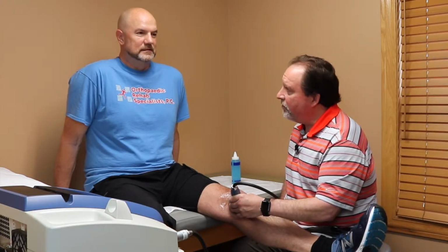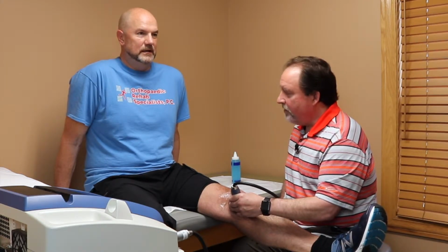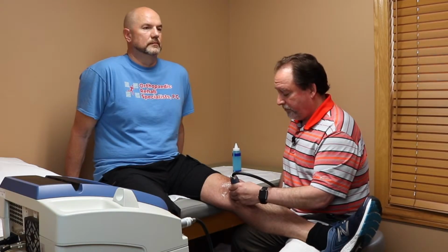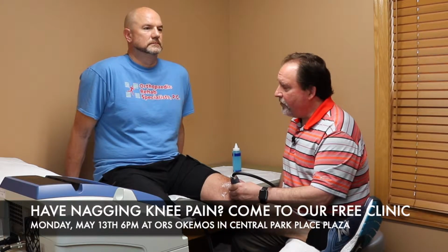Okay, we're down to 2 intensity. See, it doesn't take much. Our intensity goes from 0 to 18. That's accurate right there. That is right. Yeah, that's the spot. Still on it? It's easy to move off of it. You don't have to move far.